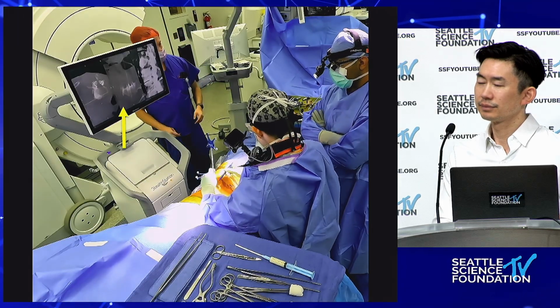Yeah, also, when we're using navigation, I always remind people that you're getting less fluoroscopy time for the surgeon, not for the patient. And I think at some point that's going to come back to get us. I mean, 3 or 4 CTs in the same day, which I've seen people do in our OR, is a huge amount of radiation for that patient. As you know, they shut down the room sometimes because they've had so many CT scans in there. So we think about radiation to us, but at some point we're going to have to start considering radiation to the patient too. Yeah.